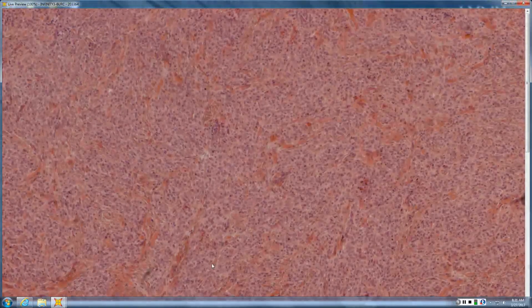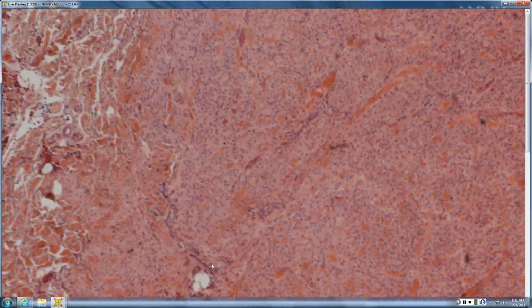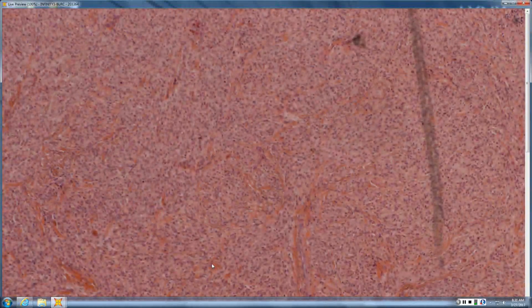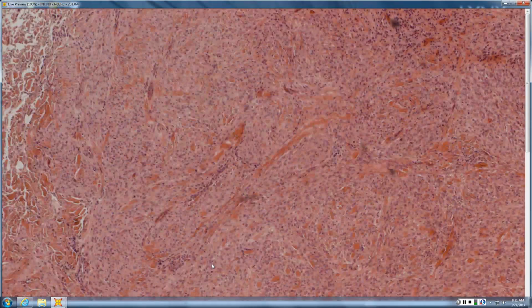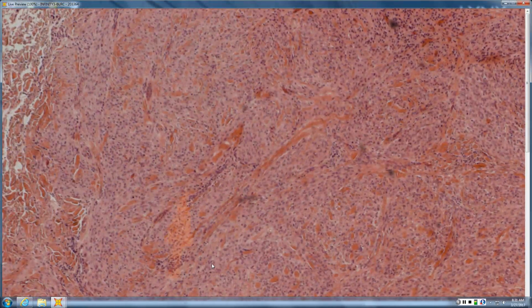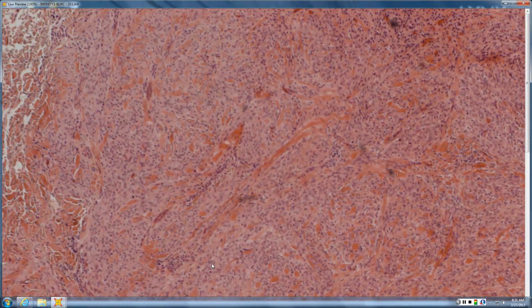This is a cellular neurothekeoma. It's cellular. It runs in thecae. It's S100 negative. It is usually S100A6 and NKI/C3 positive. They sometimes either trap or make little bits of ropey collagen because it's truly a fibrohistiocytic tumor. Okay, good.